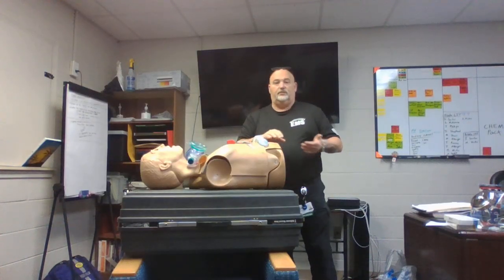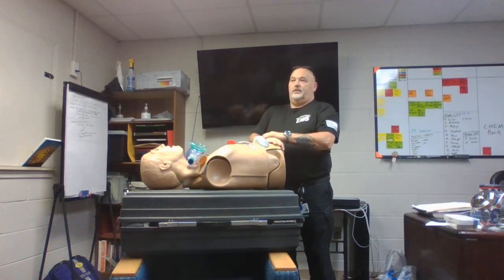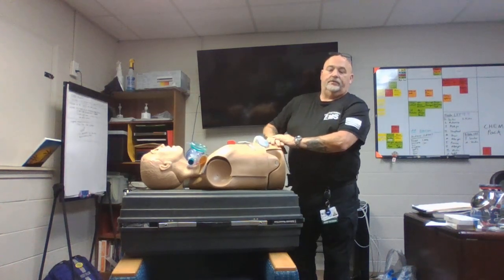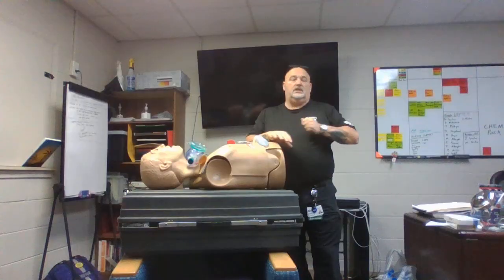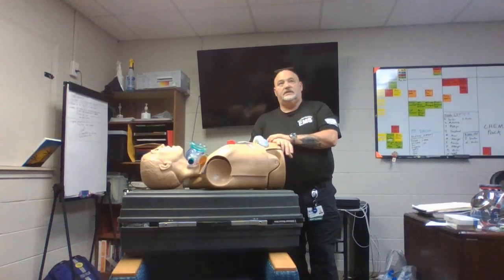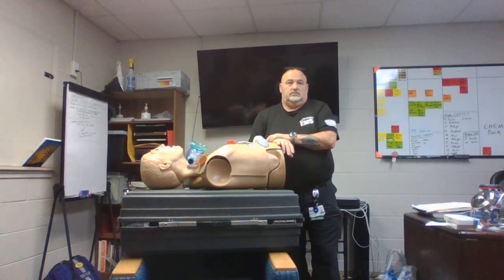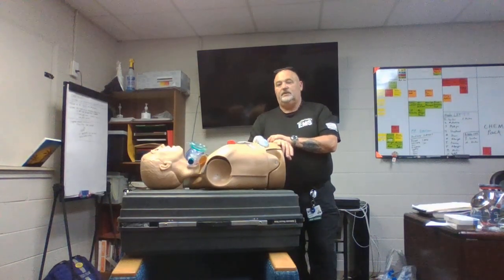the adult non-rebreather. The adult non-rebreather is for your hypoxic patients, usually whose sats are anywhere from 60 to 85, 90, depending on the provider.